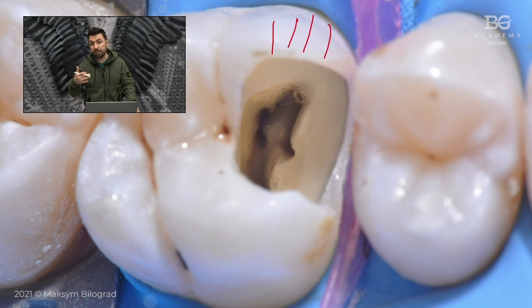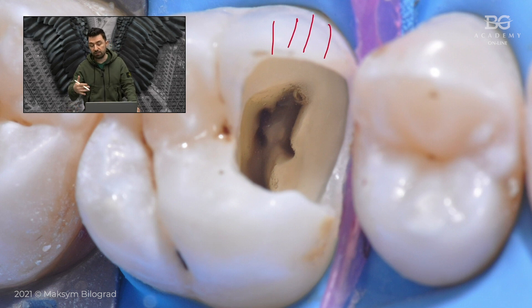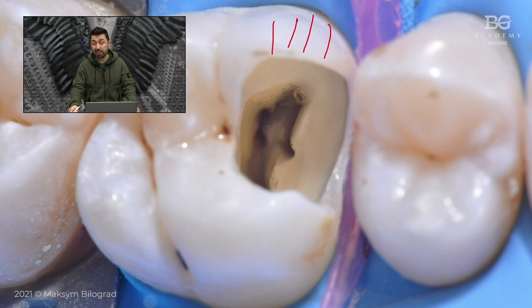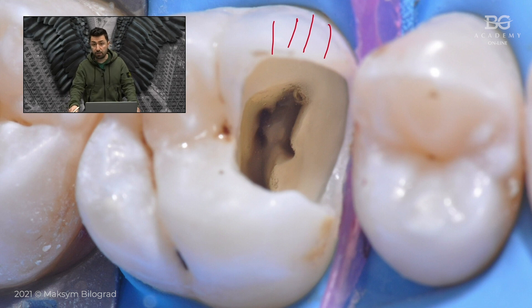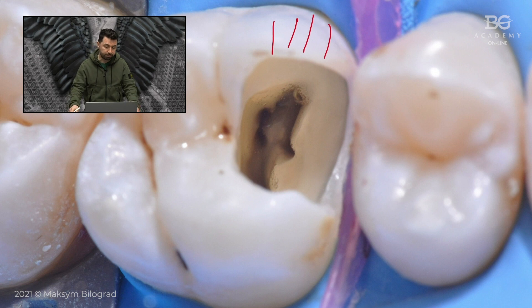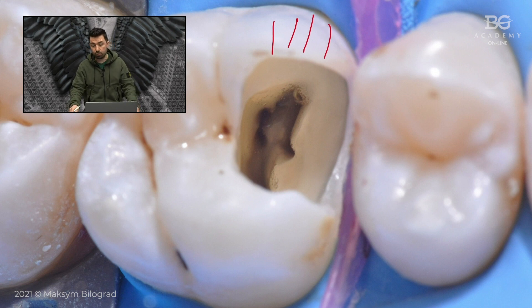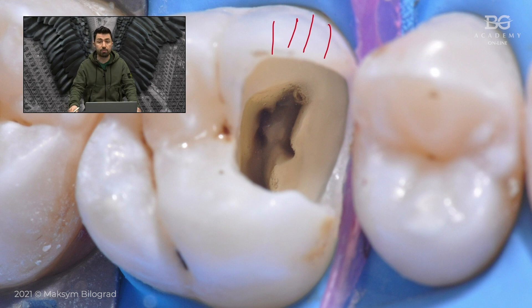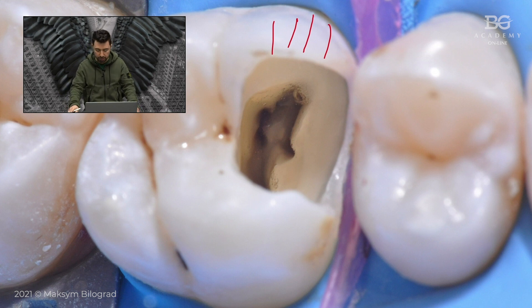The vestibular mesial aspect of the wall became very thin — thinner than 1.5 millimeters. That is why we decided to cut the cusp later on during the process of restoration, as you will be able to see.